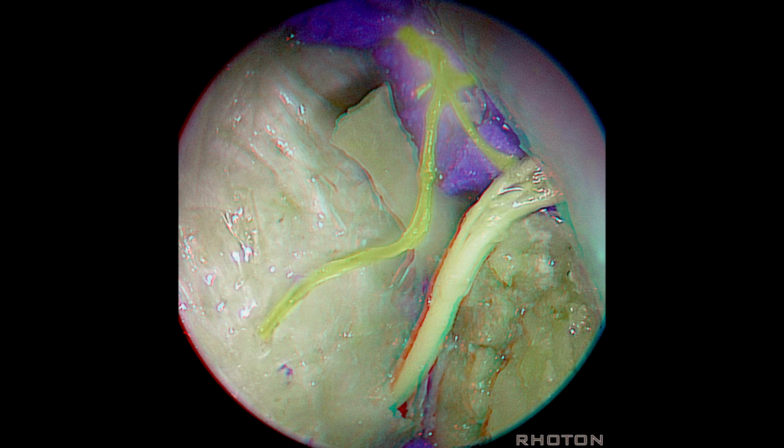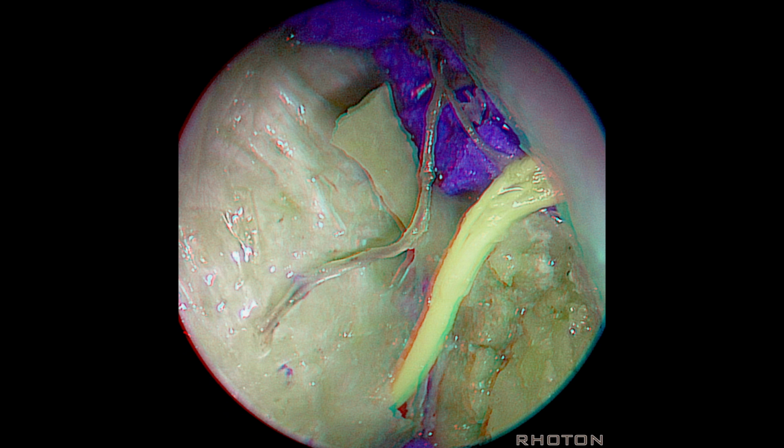Just a thought. Here we see 6th nerve coming through the dura, running medial to V1. Here's a dorsal meningeal artery coming off the meningeal hypophyseal trunk. 6 here at dura, running lateral to the terminal petrous carotid. The arachnoid has been opened. The dura around the dural exit of the 6th nerve preserved. Here we open the distal dural ring around the carotid. We'll see that from lateral this afternoon.